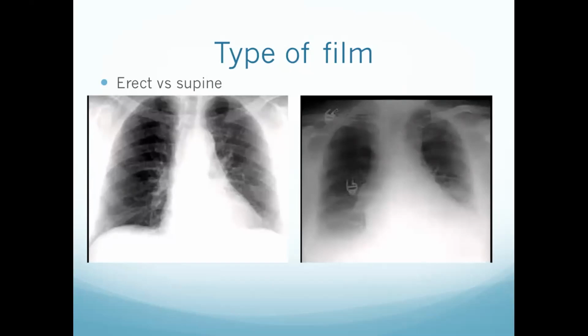And this is quite important because when I was in A&E, there was a guy who had to have a supine X-ray. He had some back pain and couldn't stand up at the time. So he had his X-ray, we got it back, and it was just around when COVID started as well. So everyone thought, oh dear, it's a terrible X-ray. And we spoke to radiology about it. They said, well, it's because he's supine, so I reckon if we get an erect one, it'll be fine. And he was absolutely right. After we got the erect chest X-ray, it was a completely normal X-ray. So just something to look out for and be careful with.